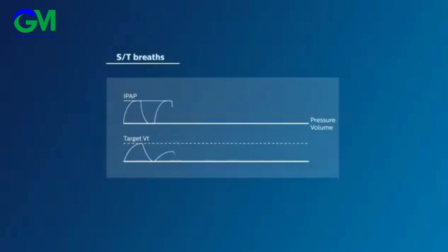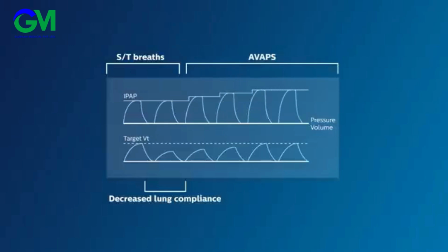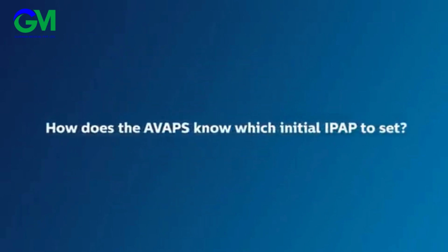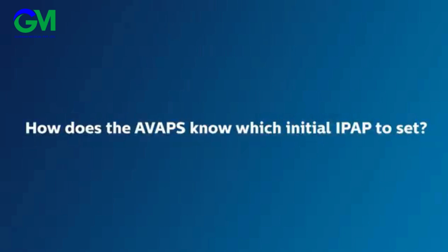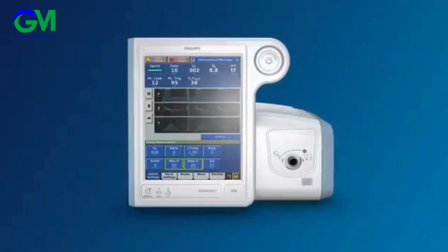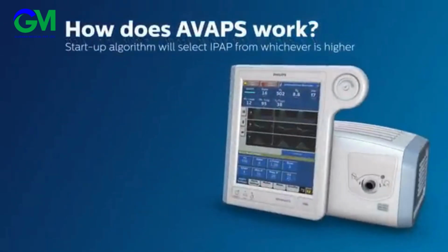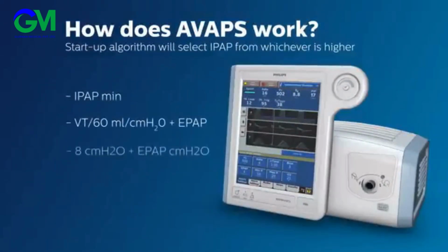Remember, in chronic conditions, patients' lung compliance and effort may drop if the disease progresses. AVAPS mode can assist many patients in maintaining their tidal volume. In fact, it can assist many patients with chronic respiratory failure in need of ventilatory support. How does the AVAPS know which initial IPAP to set? In other words, even though you set a range, how does AVAPS know with which pressure to begin the first breath? And the answer is, AVAPS has a startup algorithm and will automatically select whichever value is higher.